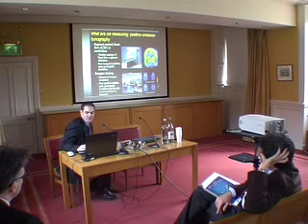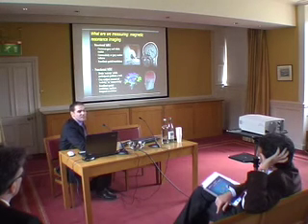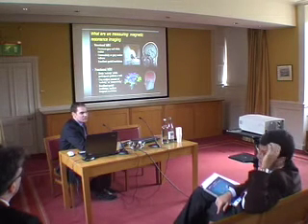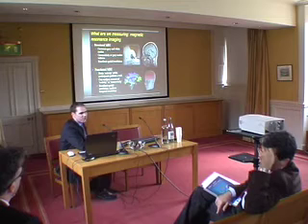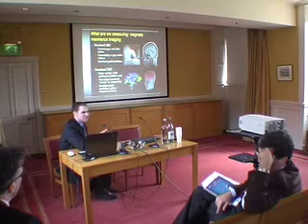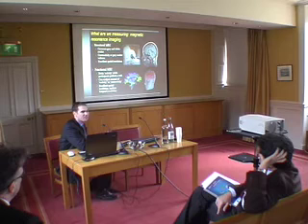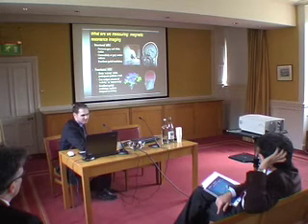But for the most part, modern studies of brain imaging and psychology really use magnetic resonance imaging, or MRI. And there are two forms of MRI that are commonly used. One is called structural MRI, and that gives us a nice clear picture of the brain structure, maybe down to a 1 millimeter voxel. So a voxel is a volumetric pixel, a pixel in 3 dimensions, so little boxes through the brain. So 1 by 1 by 1 millimeters, which is quite good, so you can see it very clearly.